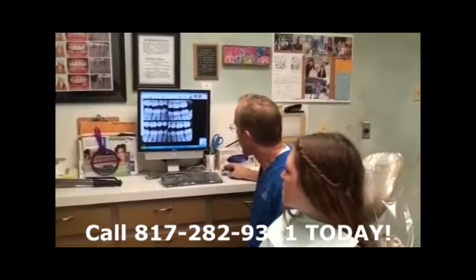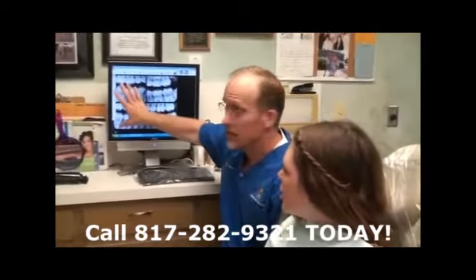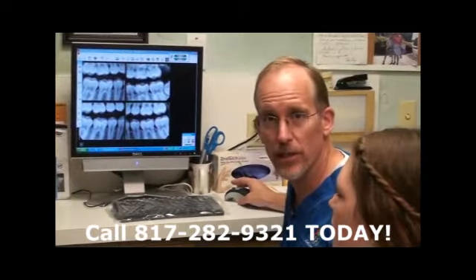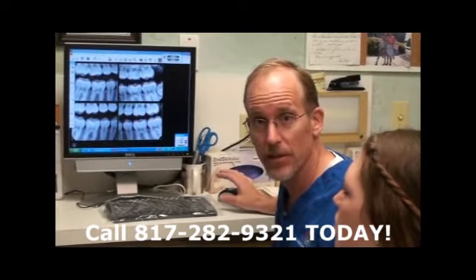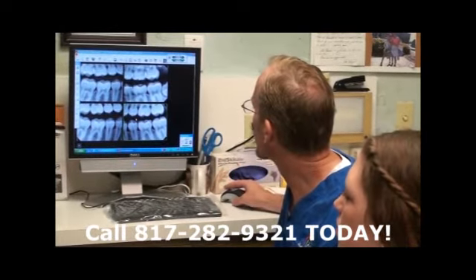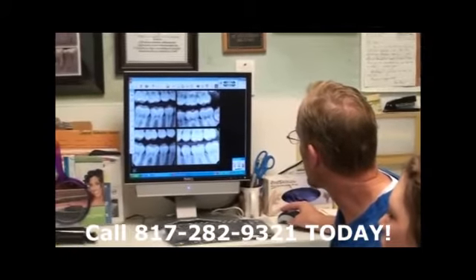Okay, so here we have our digital images. What we have is the right side of the mouth over here, and here's the left side. Basically, these are the molar region, so these x-rays don't show the front teeth, but you could take digital x-rays of the front teeth also. What we always look for is contrast in the image itself.